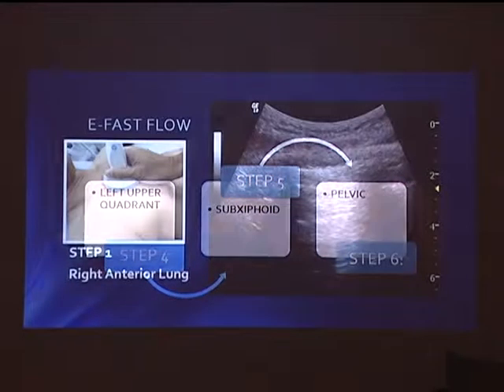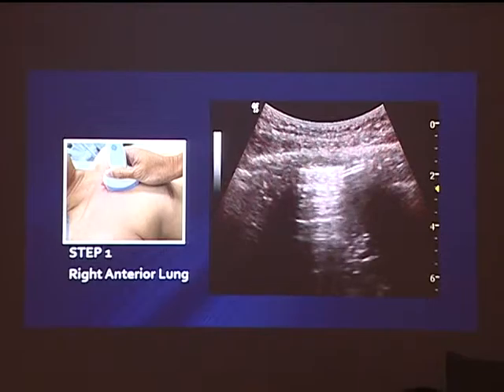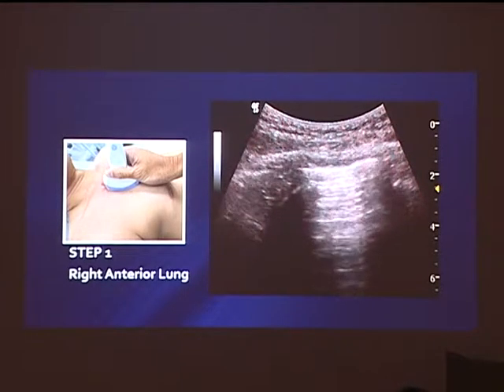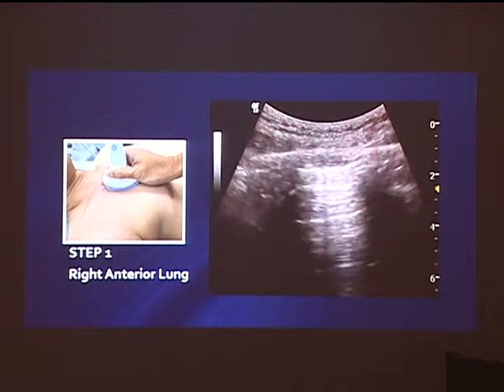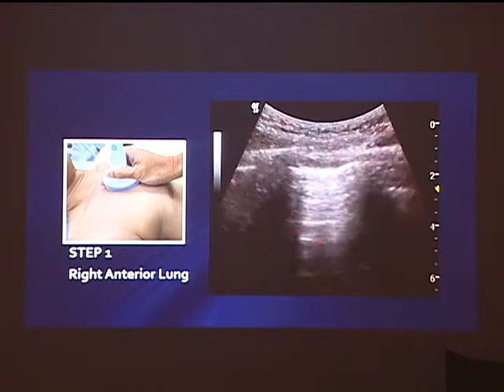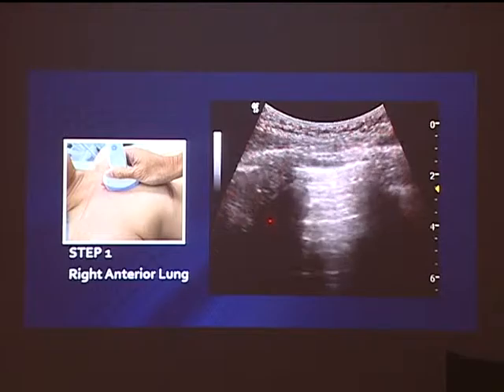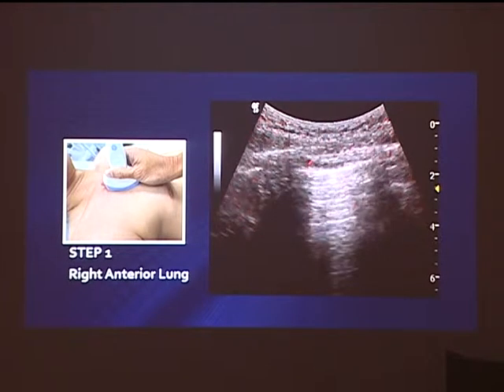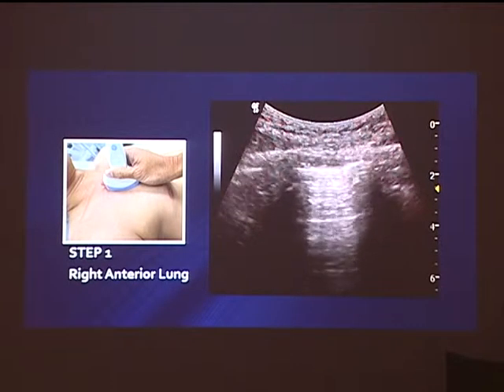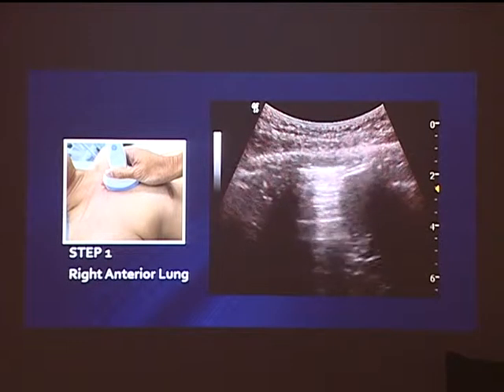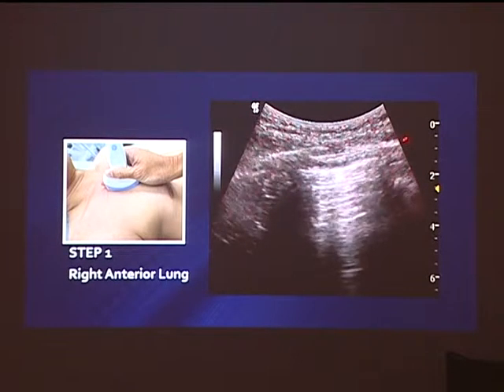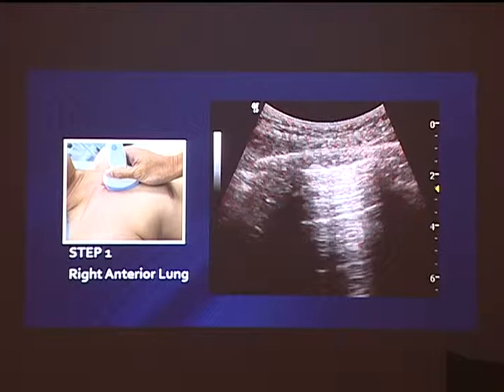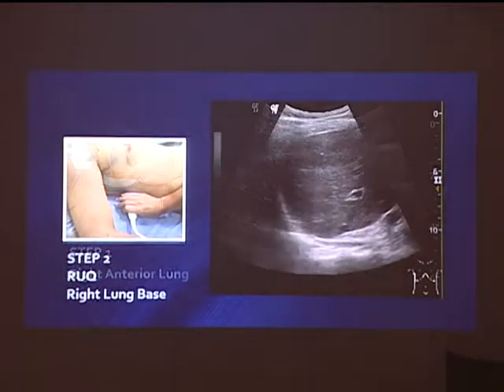Let's look at what we should see. This is a scan of a normal person. What do you see? Lung sliding — that's precisely what we want to look for to rule out pneumothorax. In this case there is no pneumothorax, in a trauma position.